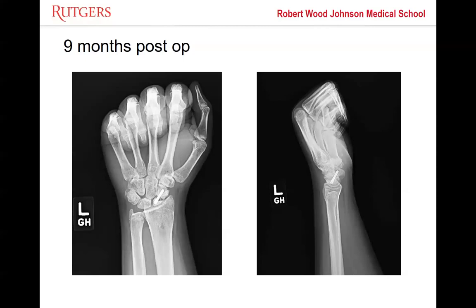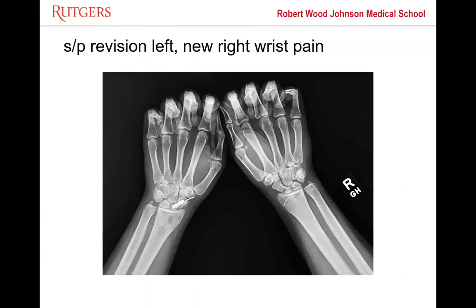So I did exactly that. I revised it. I do. But in this case, I just packed the hell out of it with iliac crest. I mean, that to me seemed reasonable. Literature really doesn't show a big difference on the vascularized bone graft. I didn't get any additional imaging. And then I upsized him to a standard screw, and I didn't have stability. So I put an extra mode of fixation, which was this K-wire, and then I thought I had better control of things.